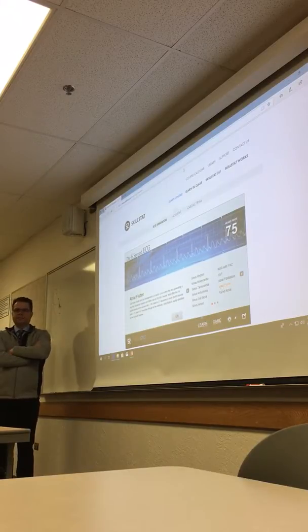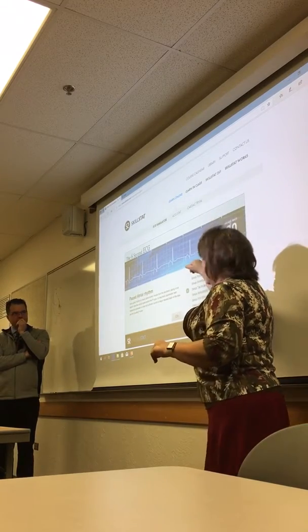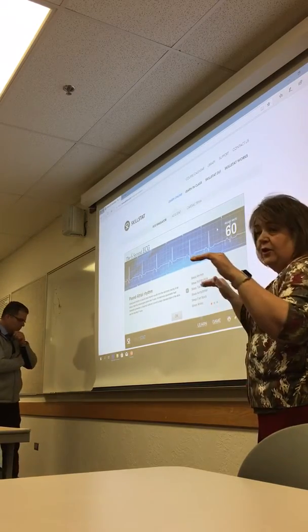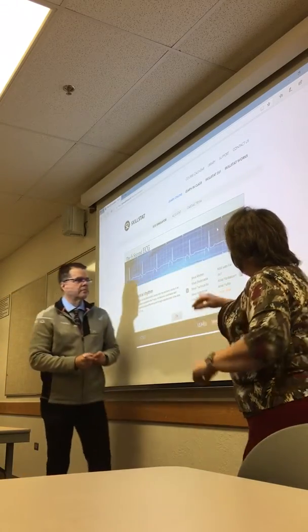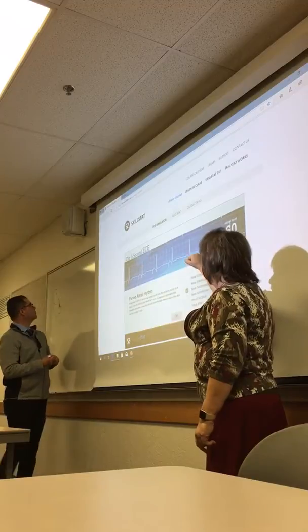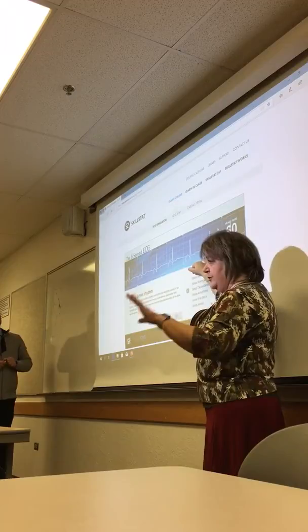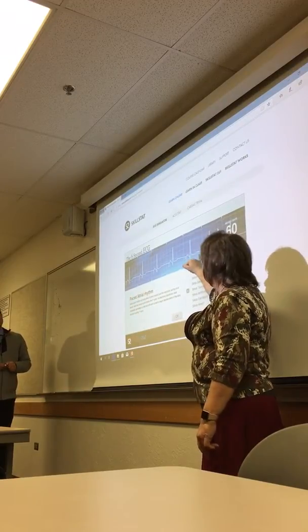You see this. Okay, now we have a paced atrial. That means your patient was not able to maintain a normal heart rate, so I had to put a pacemaker in. So these are pacer spikes. Usually when you look at the pacer spikes on the 4th floor, they'll be white, a different color than your rhythm, so they're very easy to pick up, although they don't always show up. So this was a pacer spike, and then we had a P wave, so this stimulated the SA node to send an impulse. Then we got a P wave, we have a narrow QRS, so we know this is atrial.